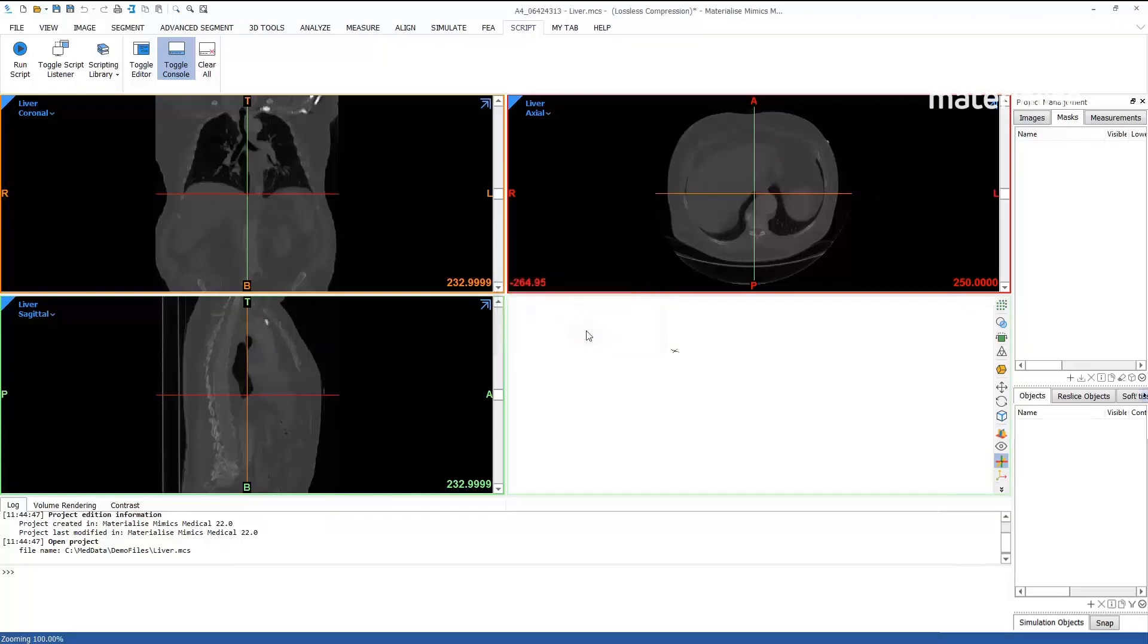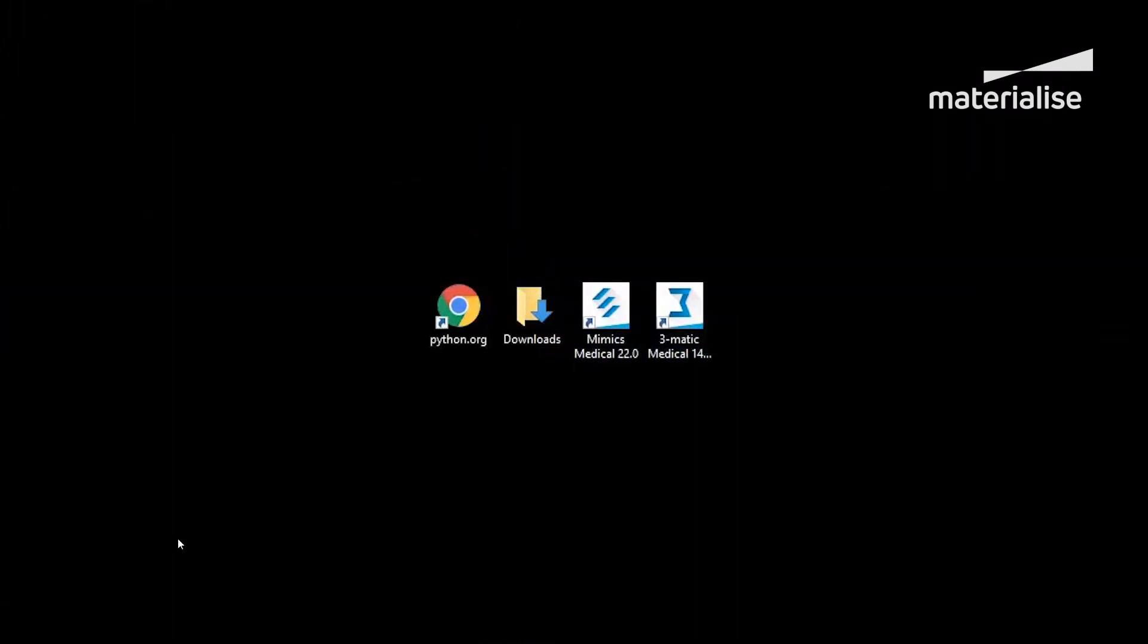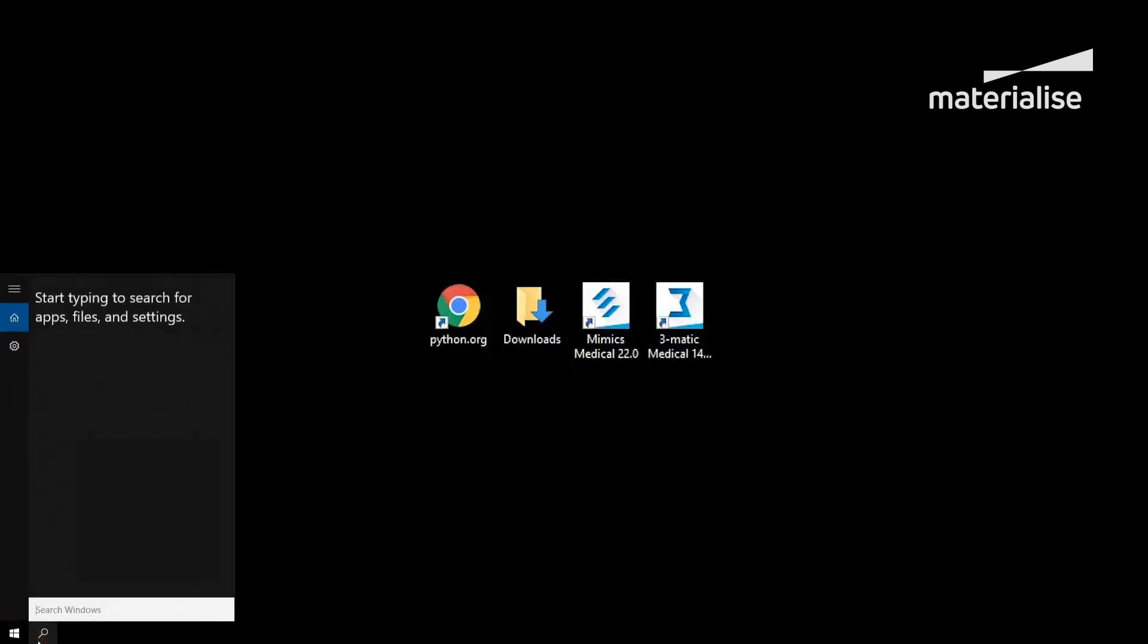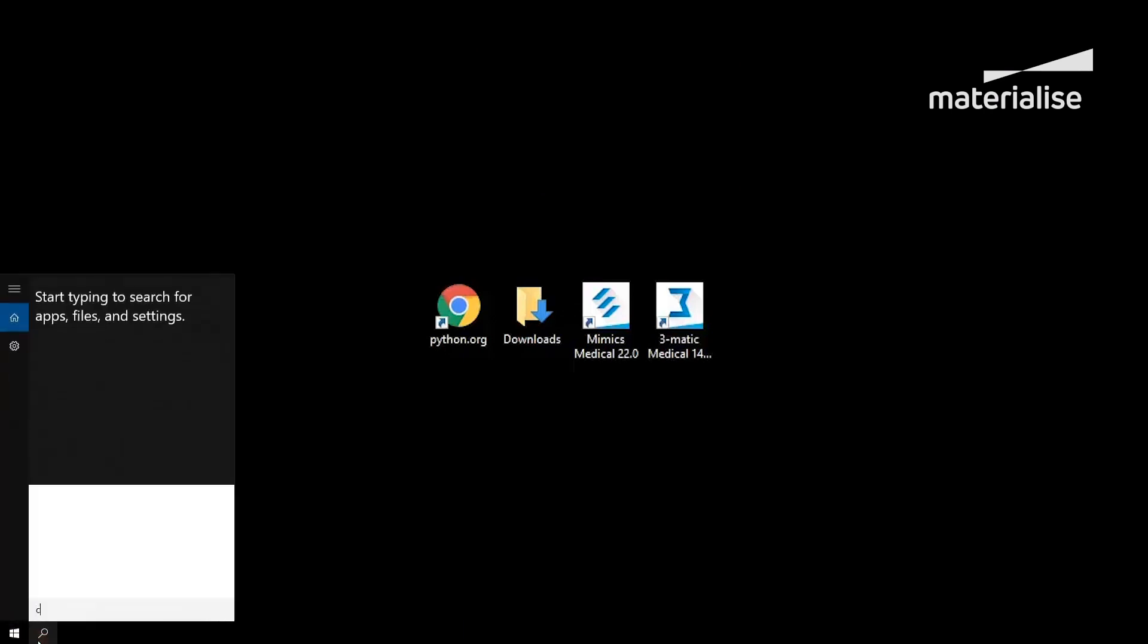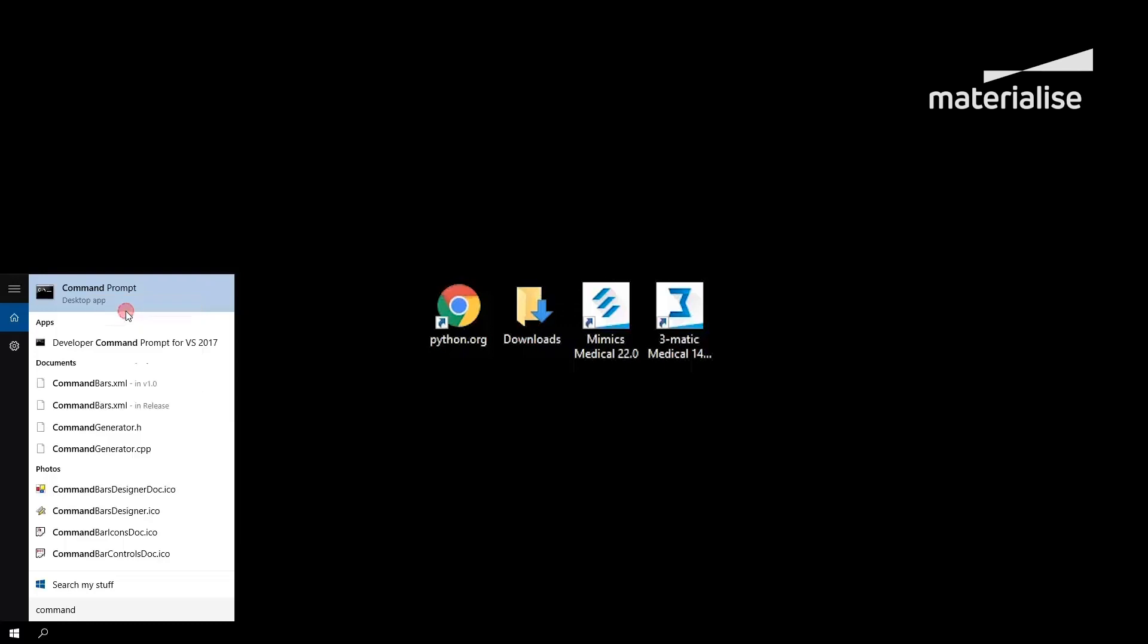Before we can complete the configuration for 3-matic, we first have to add two Python packages, JEDI and RPYC. Search for the command prompt via the Windows search bar and right-click on it. You should then choose to run the application as an administrator.